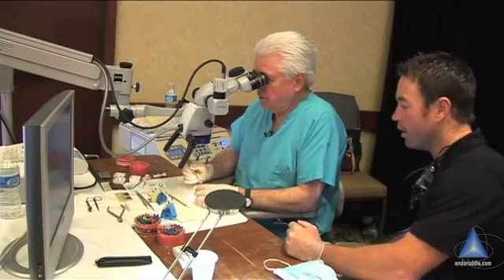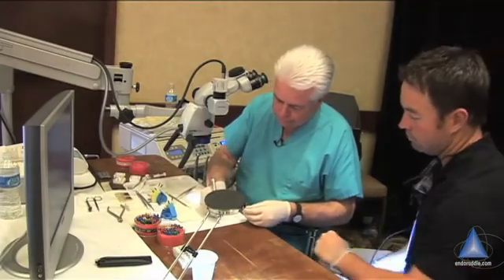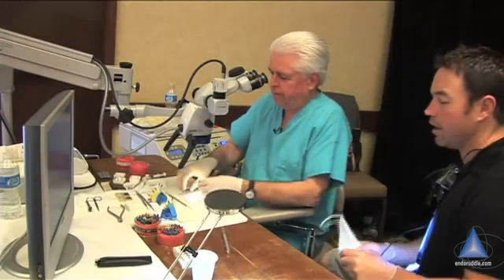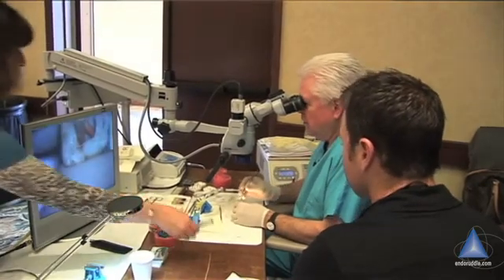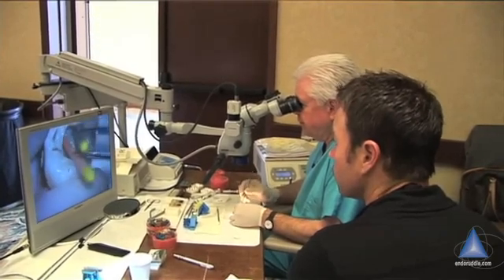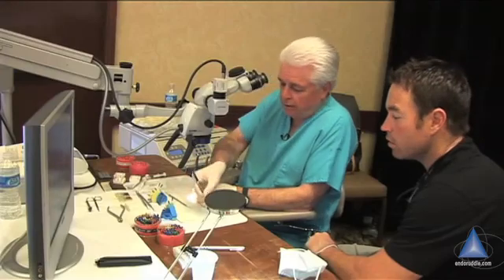Do you mind if I pull these out? No, go right ahead. Can you hand me that pen? So I don't screw it up — this is a maxillary molar, right? Yes. And you got a palatal — so this should be our palatal, and this should be our MB over here. You have good tug-back. I like that. I'm pulling them out and I'm feeling resistance — short, crisp tug-back. That's good tug-back. Nice.